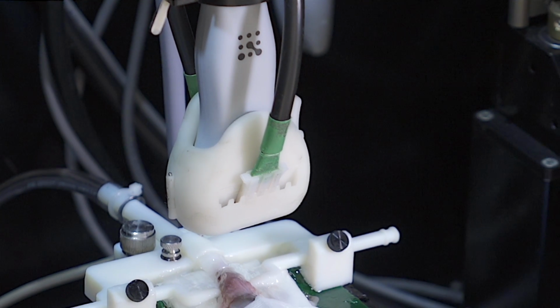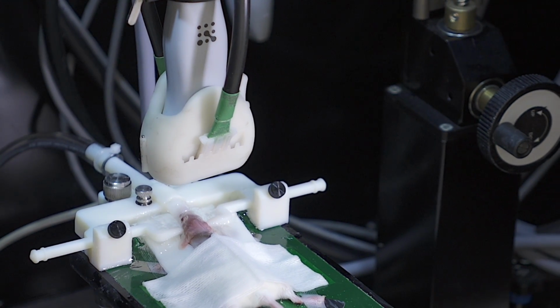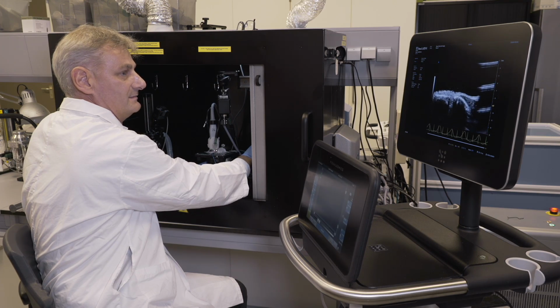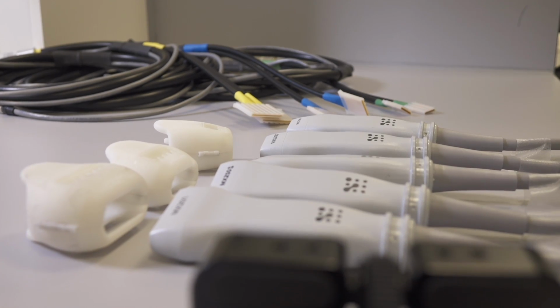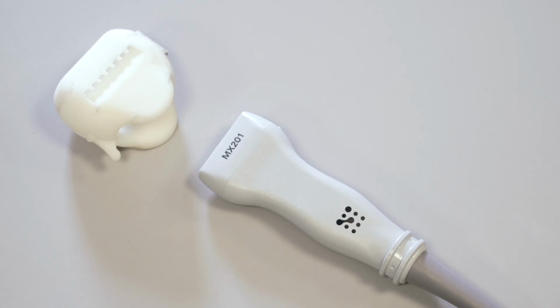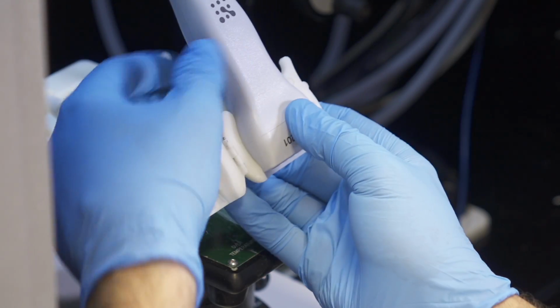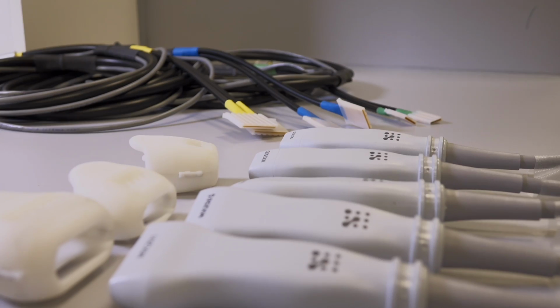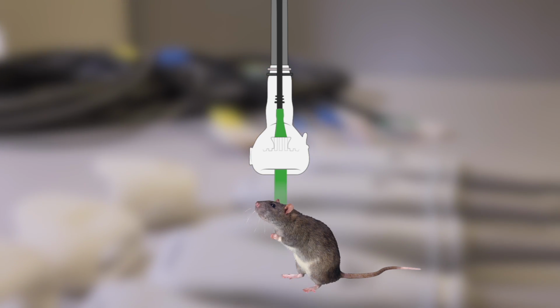For setup, the mouse imaging platform incorporates a highly innovative stereotactic frame. This allows the head to be fixed in place for straightforward and reproducible brain imaging. The Vevo Laser X is fully customizable for your research. Here we recommend the MX201 transducer at a central frequency of 15 MHz. This, in combination with the narrow optical fiber, will allow deeper brain imaging through intact skin and the skull.